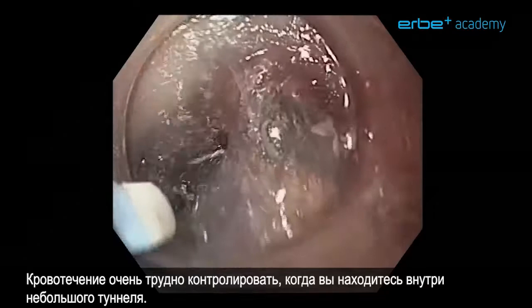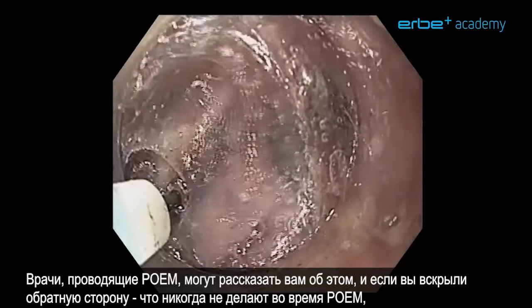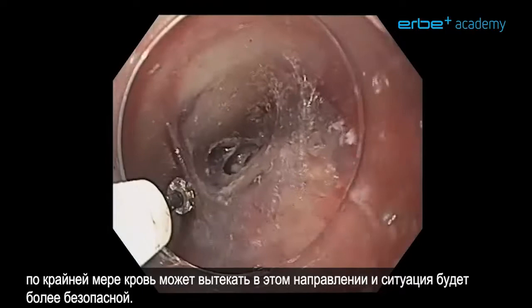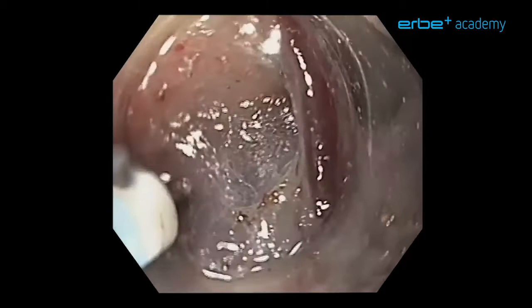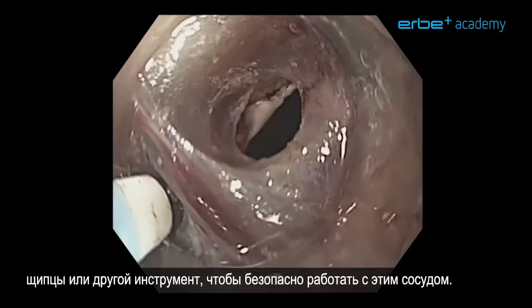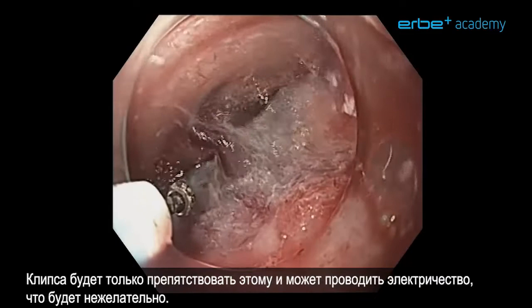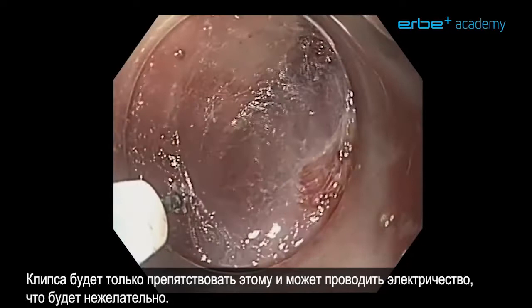That has another advantage: when we try to treat this vessel and it might start bleeding, bleeding is very hard to control when you are inside a small tunnel — people who perform POEM can tell you all about that. But once you have opened the back side, the blood can pour out in that direction and you will have a more safe situation. Never use clips in this situation because you need to continue your dissection and a clip would hamper that and might conduct electricity.